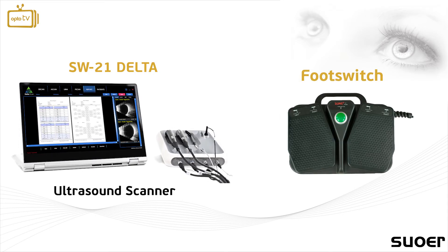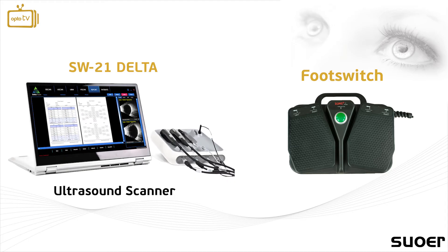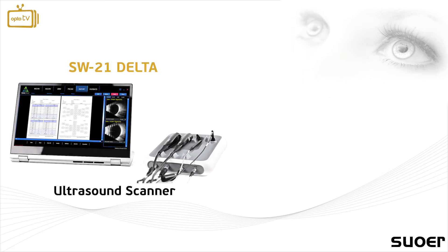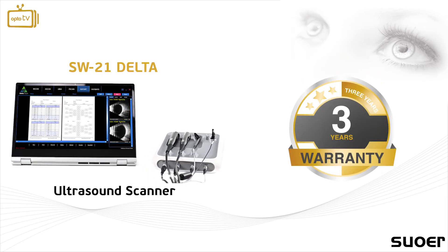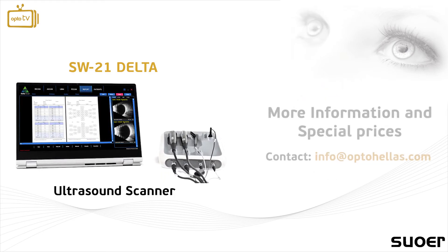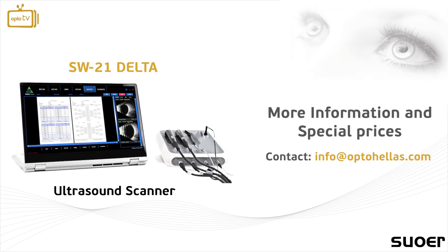The instrument's footswitch is also included and allows the user to capture and run all examinations easily and efficiently. The SW21 Delta Ultrasound Scanner comes with our 3-year OptoHellas warranty. For more information and special prices, contact us at info@OptoHellas.com or visit our website at OptoHellas.com.